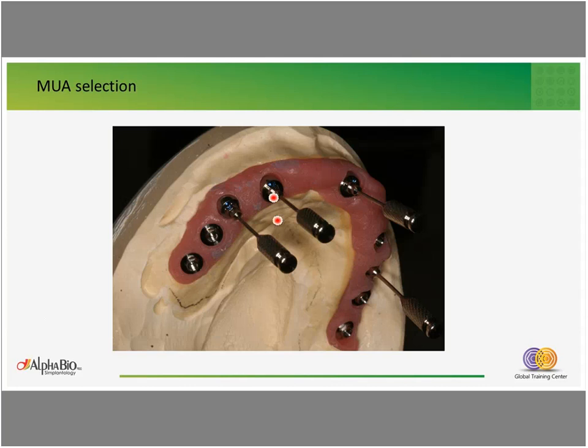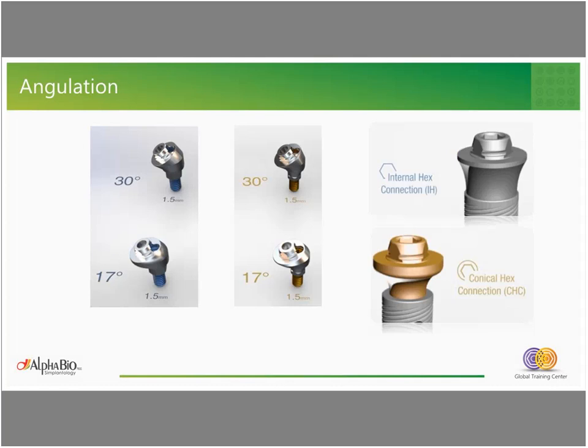So we can change the entrance of the screw from the buccal side to the lingual side, so that we can make a screw-retained restoration without any aesthetic compromise. For the straight implants, we can use the straight multi-unit abutment, which can also raise the height of the restoration to the maintenance area, and it will be much easier to maintain these cases when we have screw-retained restorations.